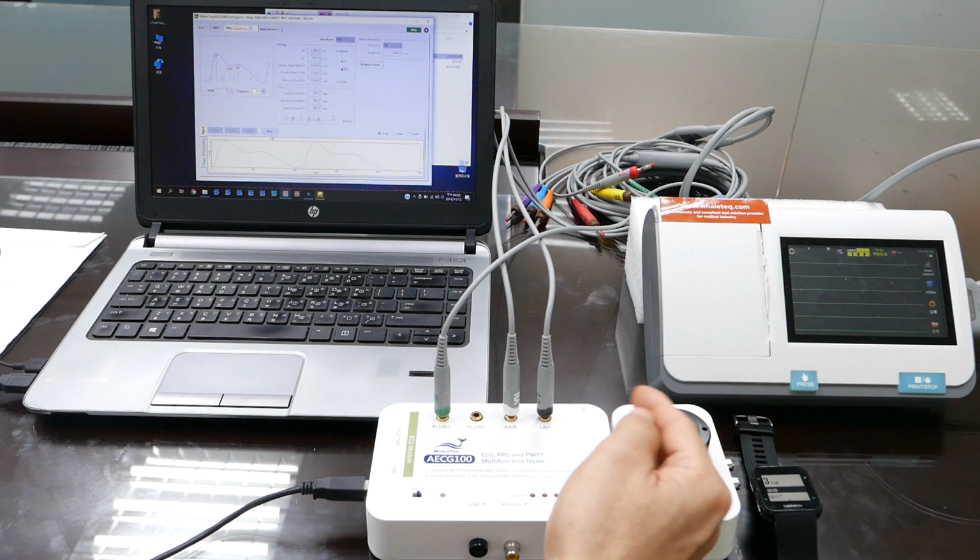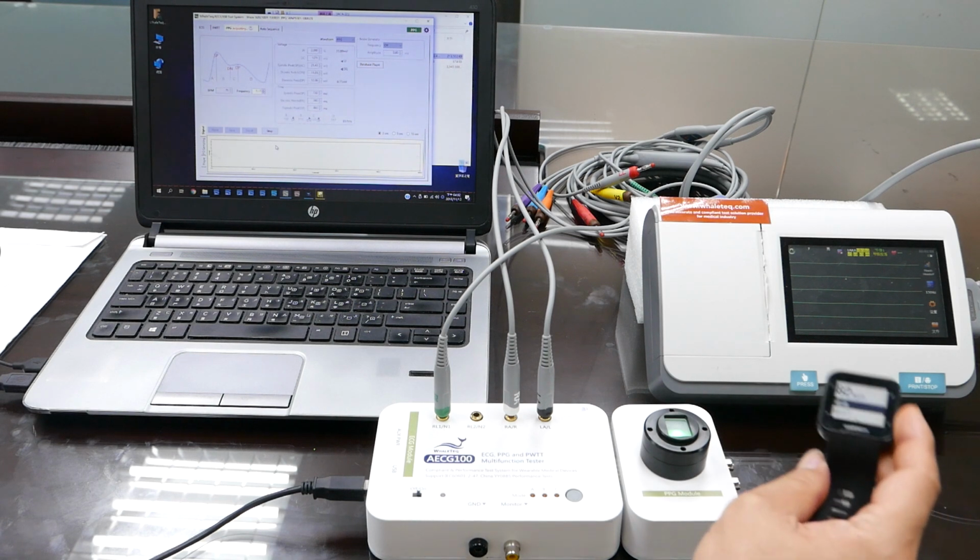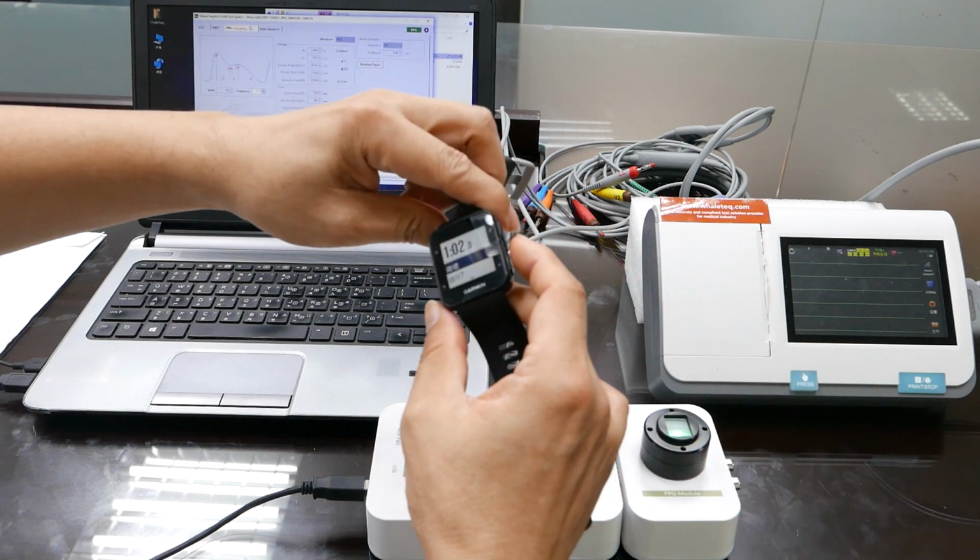It may appear unchanged to the naked eye. However, it actually contains DC and AC signals. Since the AC signal is too small, the naked eye cannot recognize its changes. Nevertheless, they can be detected by the DUT.